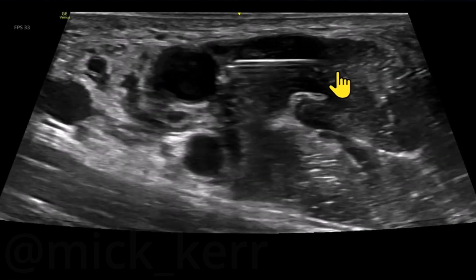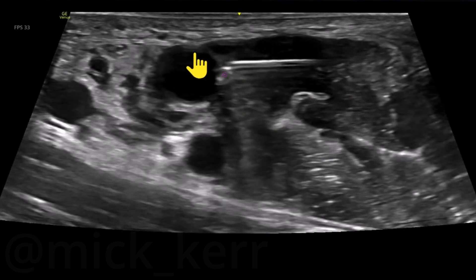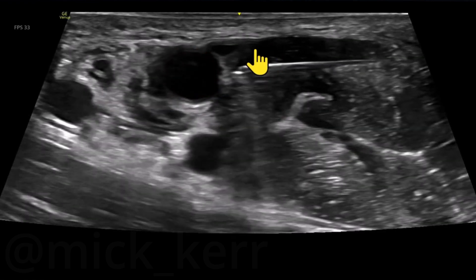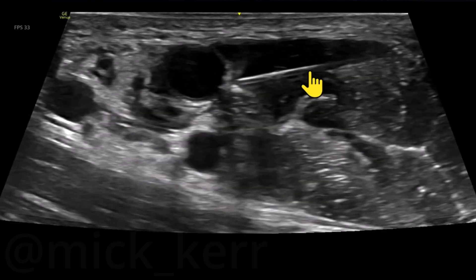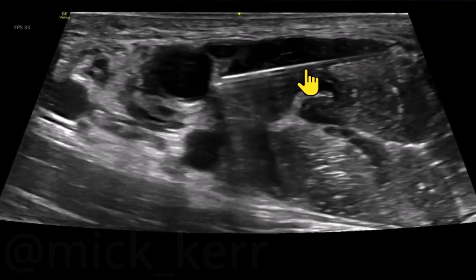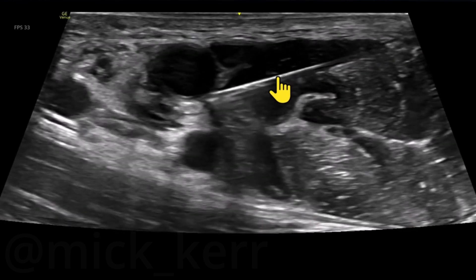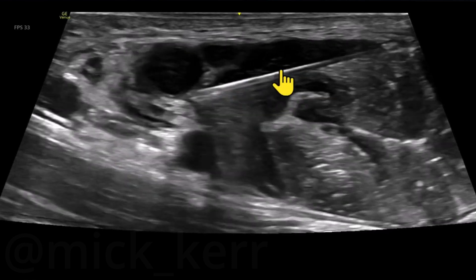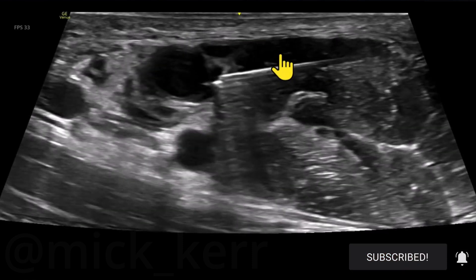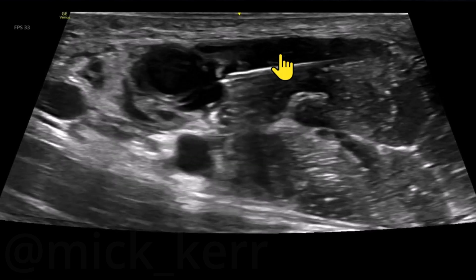Now what seems to make the most sense is popping down on top of it, but obviously we've got the artery here so I can't just skewer that. I'm going to see if I can come down through here. We've got an awake patient who can tell me if he gets any paresthesia — pushing the nerve down gently, just patting it down, a little tiny pop there. And some spread.